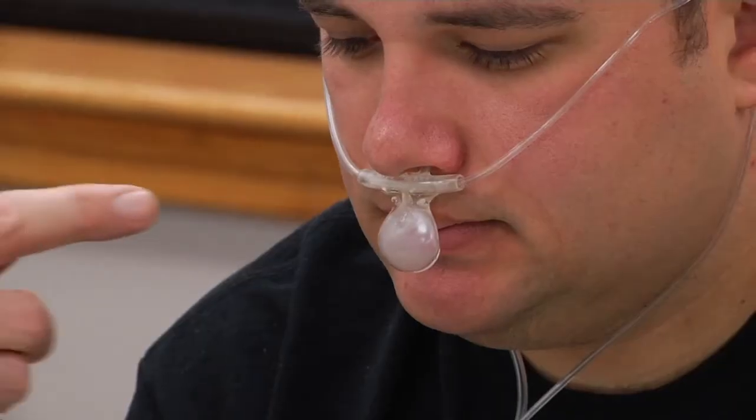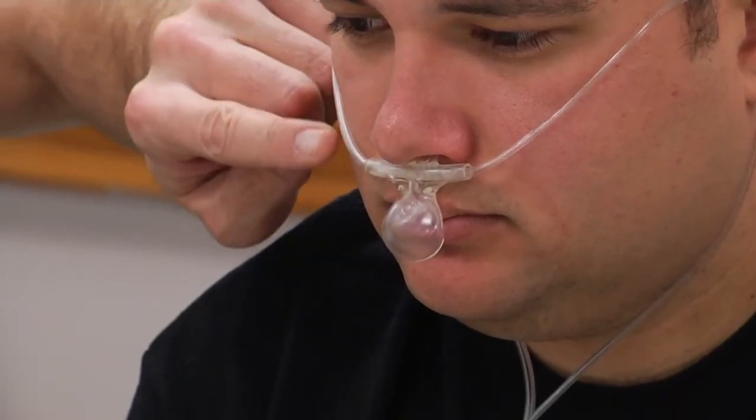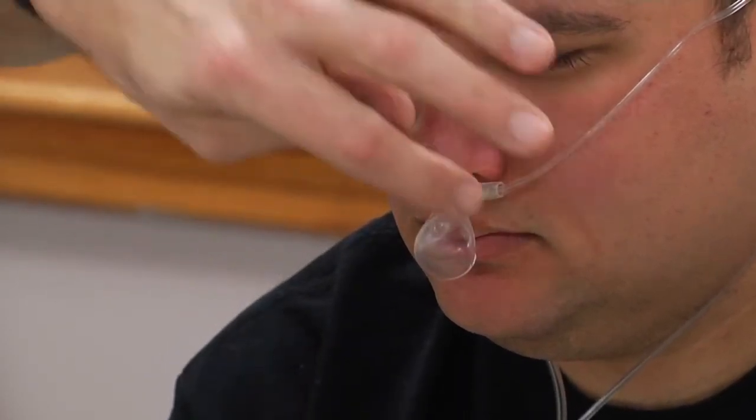If you're going to measure end-tidal using CPAP, you have to have that pillow over the mouth on the device that you're using, or the gas flow is going to dilute or wash out the carbon dioxide that you get from the patient. So the mask can sit over this. You'll see that there's obviously going to be a small leak on each side where the cannula comes out from underneath the mask. You don't want to tighten the mask too much on the patient's face because you'll cause leaks in other areas. That leak is adequate to still provide the pressure that you need on the patient.